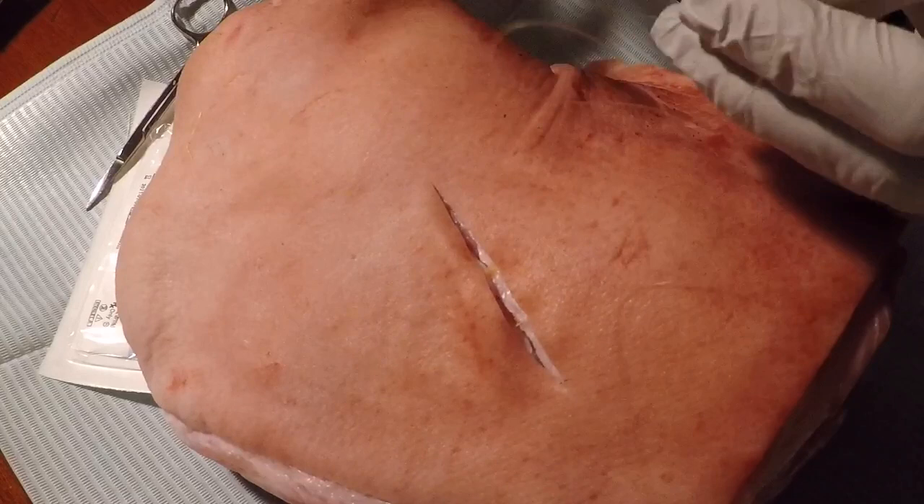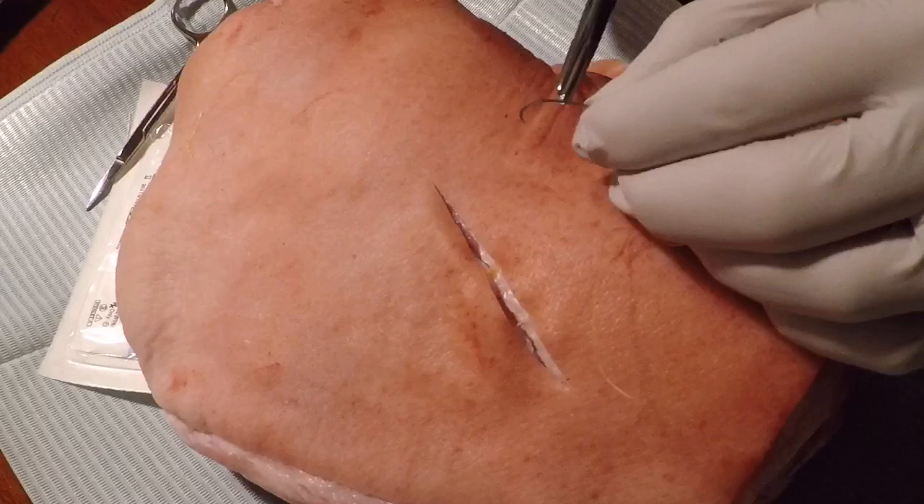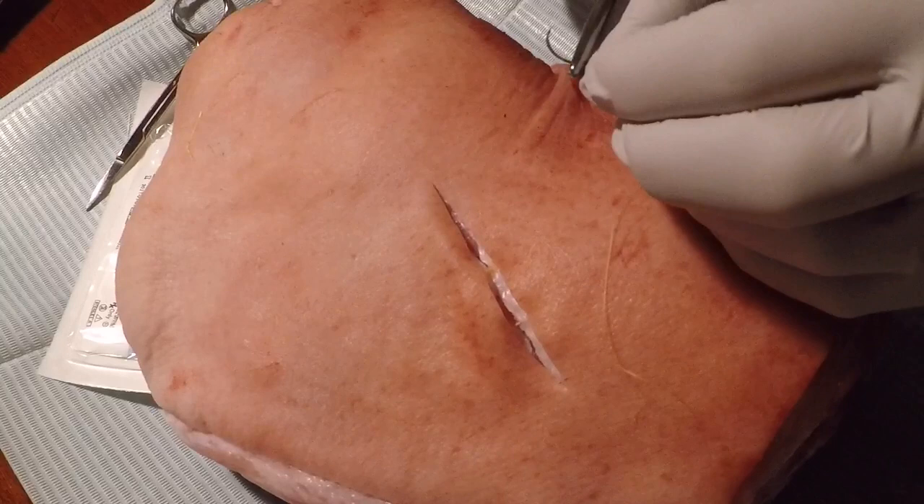One thing: as you use the needle, make sure it doesn't start bending weirdly. If it does, that means you're putting too much force too far back. If you start seeing that happen, grab it a little further forward so you don't stress the hook so much. Because if you break your suture needle, that's it for the whole strand — there's no more suturing with that one.